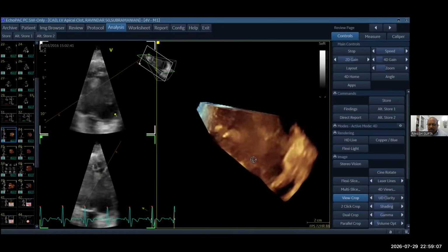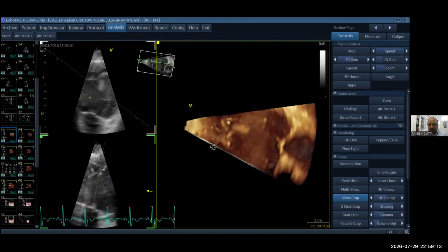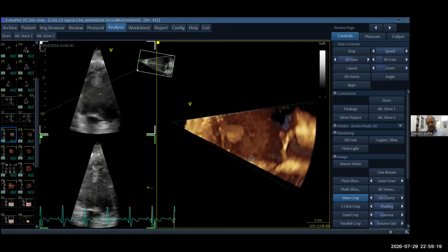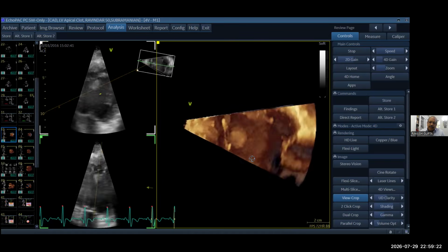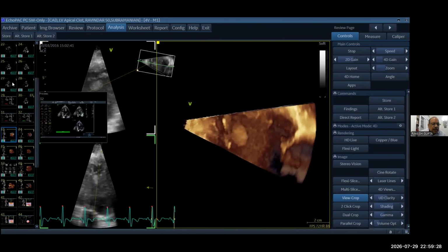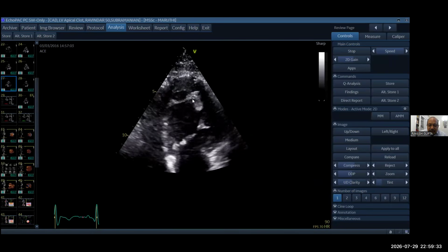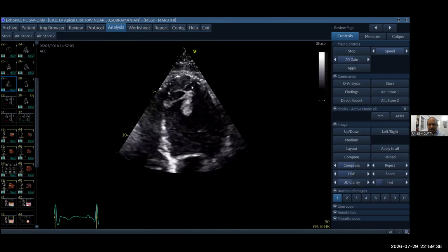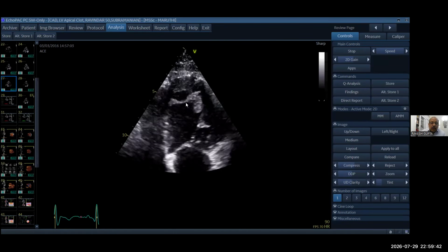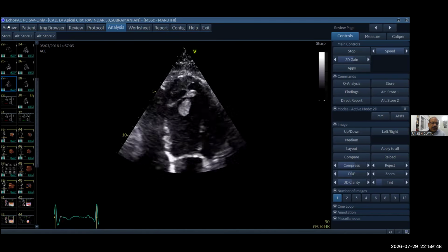And we can't leave this thrombus like this. Very high chances of developing embolism. Now you can see this pedunculated thrombus. And it has all formed because of the akinetic apex. Look here, it looks as if it's coming from this accessory band. It's not true. It's coming from the apical thrombus only, an extension. So whenever the apex gets involved, the fair chance is you have to hunt for thrombus.